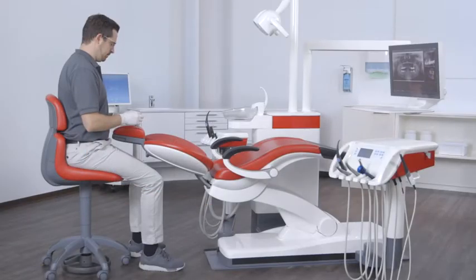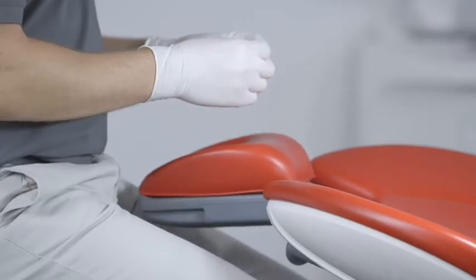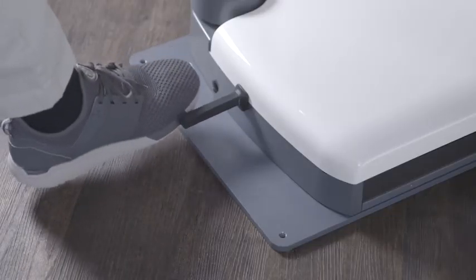So you can concentrate fully on your patient. You can move the headrest to the ideal treatment position using the foot control.